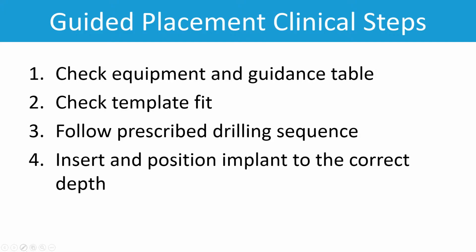With any procedure, in order to keep it safe and make sure you don't miss out any stages, it's most important to have a checklist to make sure you cover all the eventualities and procedures in order. So first of all, you check the equipment and your guidance table, which we'll look at in a moment. You check the template fit. You follow the prescribed drilling sequence as you've worked out from your initial assessment using your digital planning software, and you insert and position the implant to the correct depth.